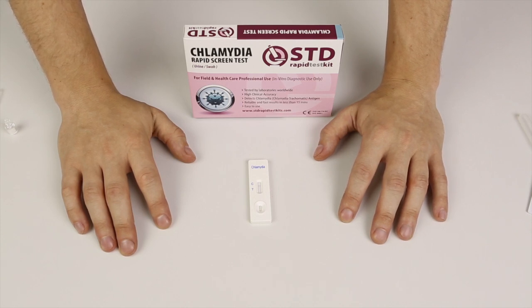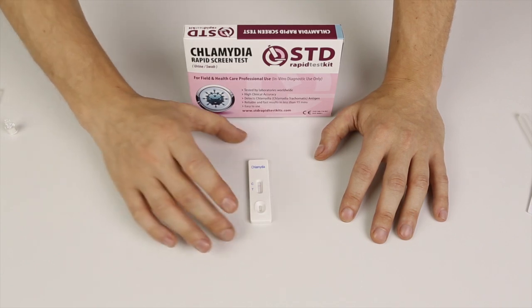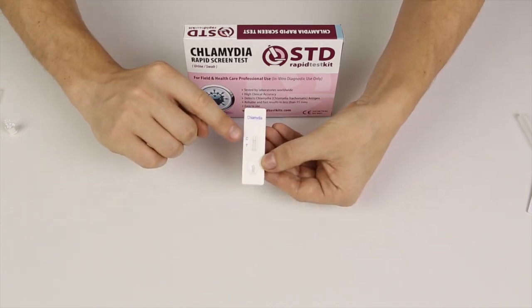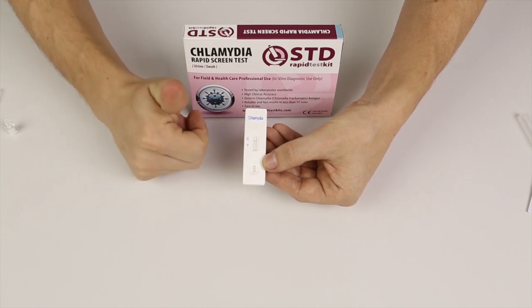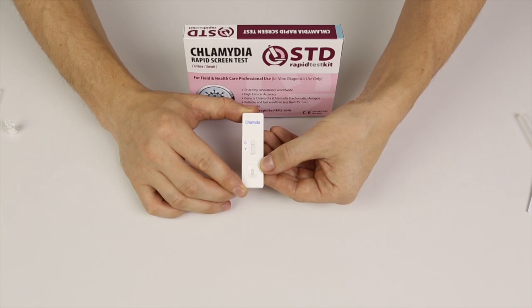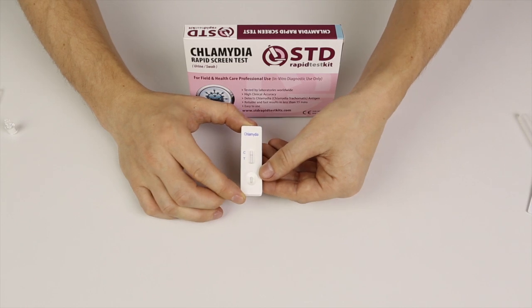We're not going to have you watch the whole wait, so we're going to forward here by 10 minutes. As you can see, only one line showed up next to the C — that means that I am chlamydia negative. If you perform this test the way I explained and two lines showed up, that would mean that you had chlamydia. And as I said, you have to go and see a doctor.